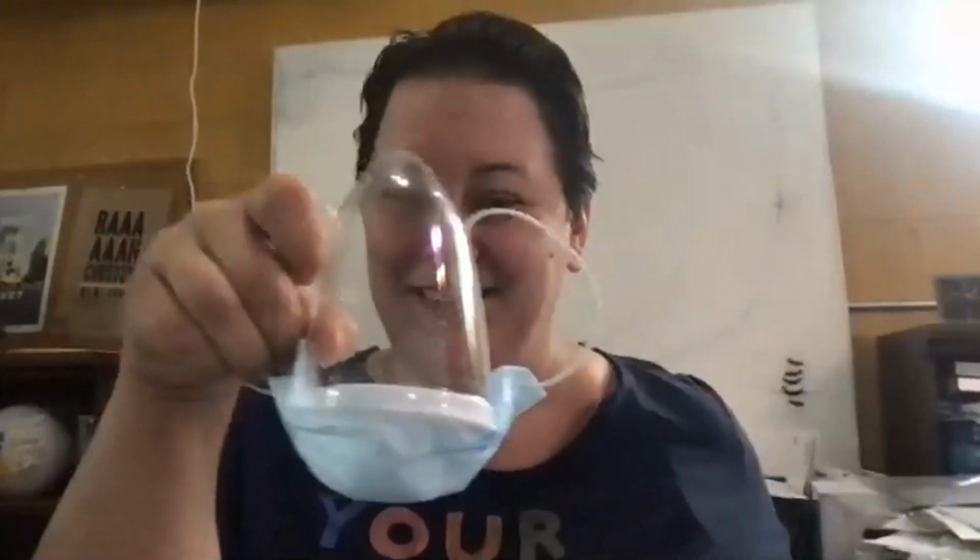And to take even another step towards accessibility, because not everybody has access to vacuum forming machines, we also came up with a way of making the same kind of mask using recycled materials. Just find yourself a 2-liter plastic bottle, and you can cut it down and bend it in a way that you can create the same kind of clear mask, or clear mask adapter, I should say, that you can use in combination with any standard mask like you see here, just a surgical mask.